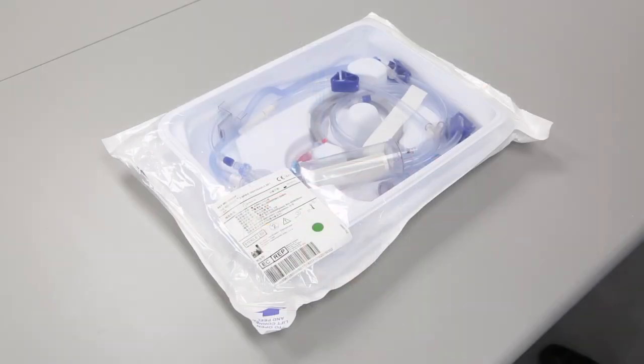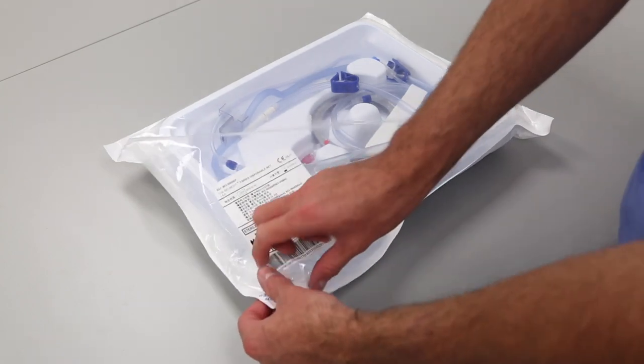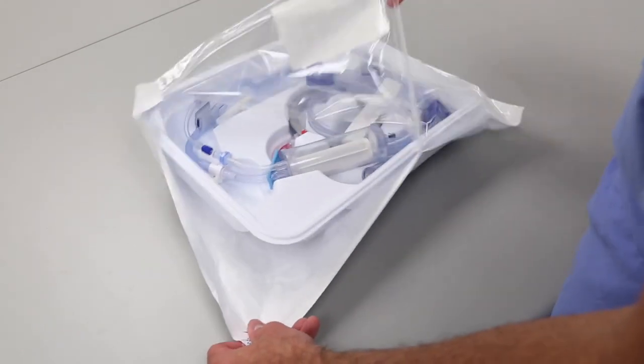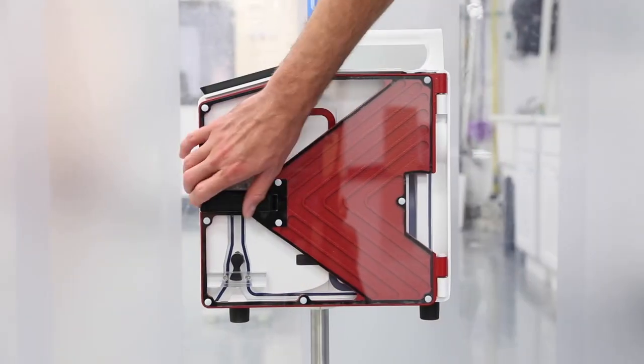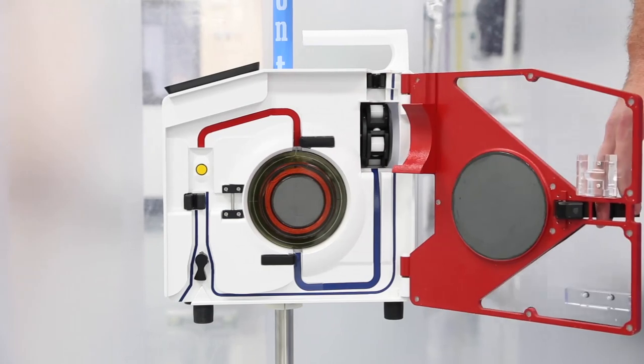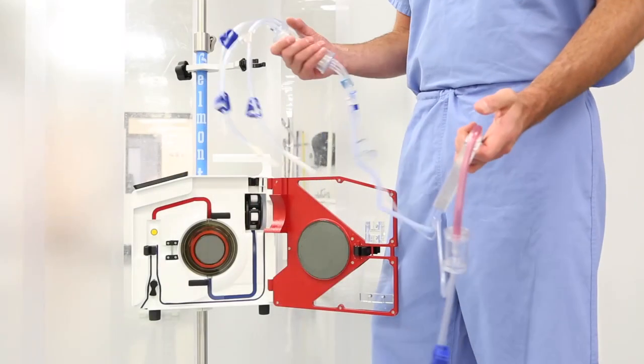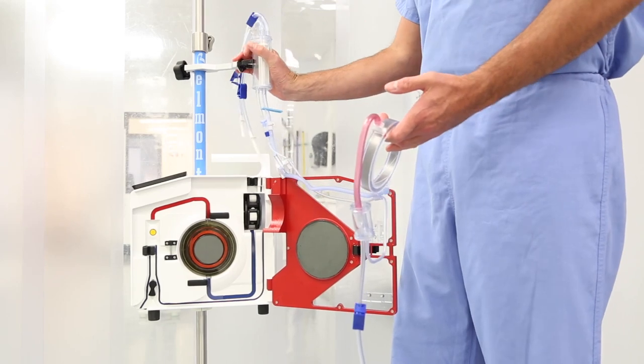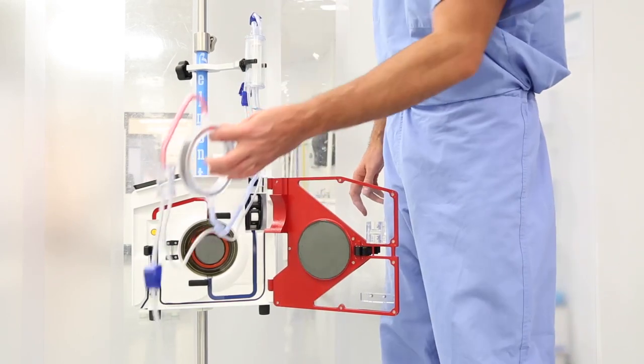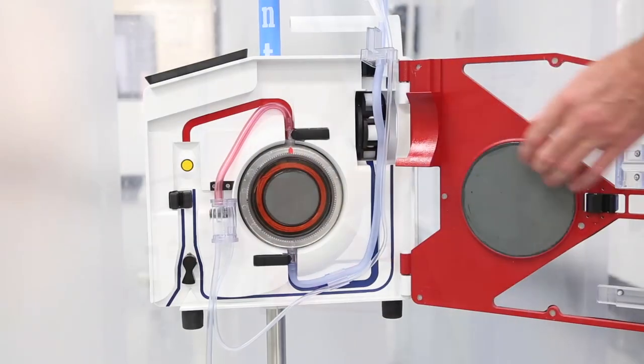The single patient use disposable comes preassembled in a sterile container and is color coded for easy installation. Begin by opening the disposable package and tightening the two luer locks. Open the door of the unit. Holding the heat exchanger in your left hand and reservoir chamber in your right, snap the reservoir chamber into the holder. Insert the heat exchanger with the red arrow pointing up.